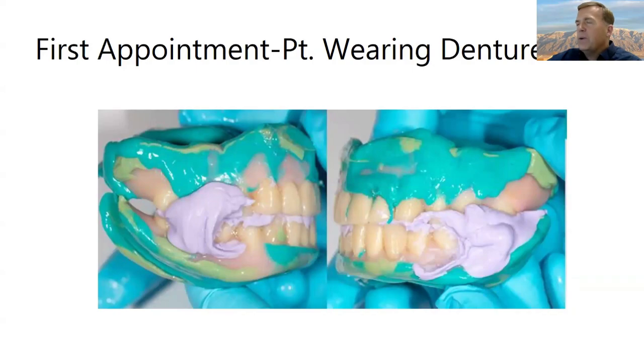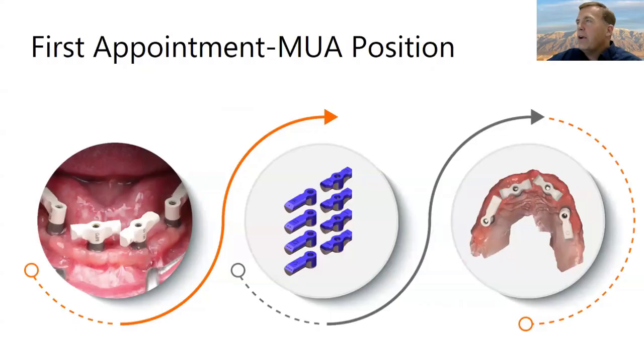You have to take a 360 scan of the denture with this. There isn't an option of just scanning the tissue. We'll take our MUA position scan. This shows a simply iOS workflow, but you can use your photogrammetry. Again, all the rules from before apply.